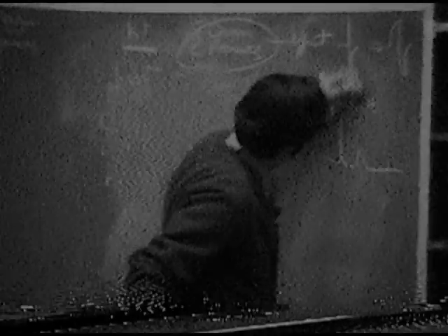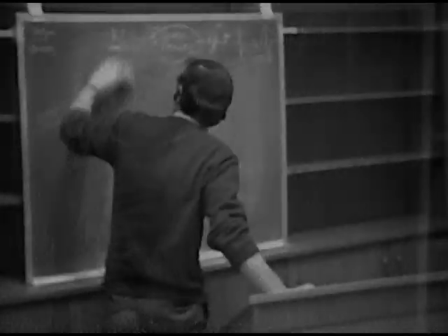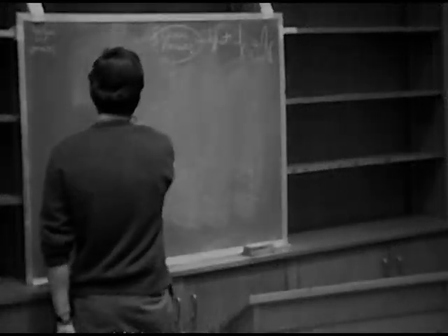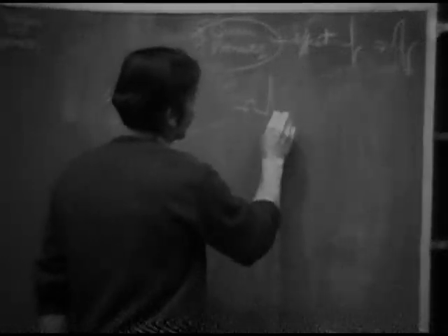Okay, now let's just go over hyperkalemia, because that does different things to the electrocardiogram. It doesn't shorten the QT interval. Normally your potassium is somewhere about 3.5 to 5.5, and you have an EKG that looks like this.